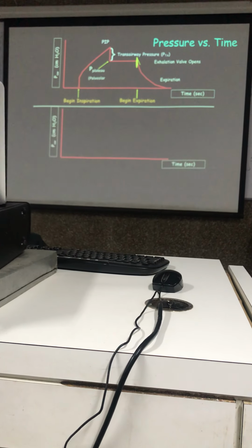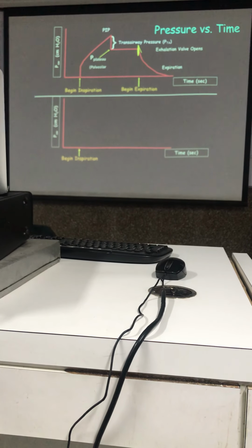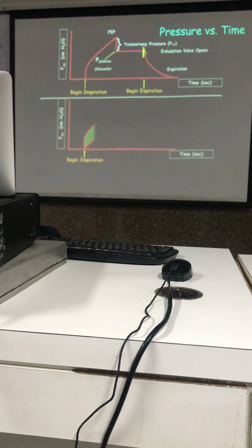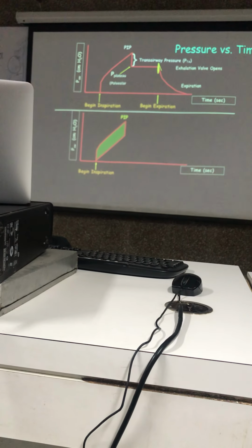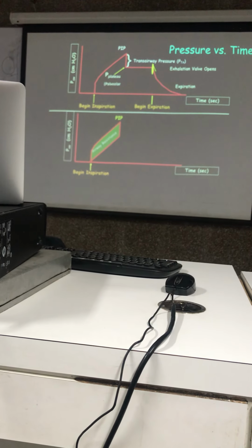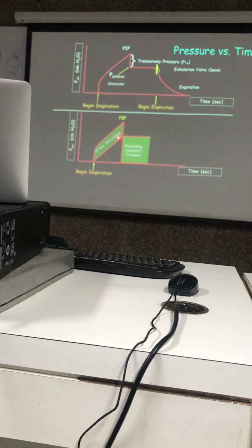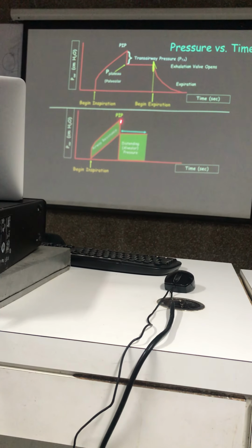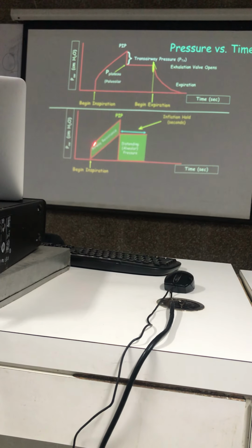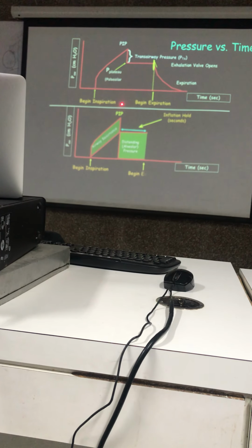Okay. So just to give you another view of what this really means, you can look at it in terms of airway pressure when it begins. This, as we said, determines resistance. So the more the resistance, this goes up higher. The peak inspiratory pressure goes up.